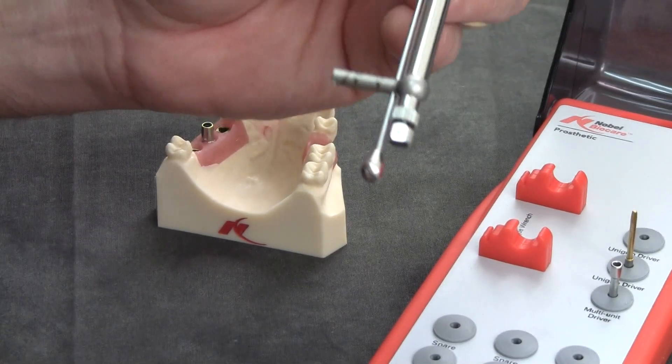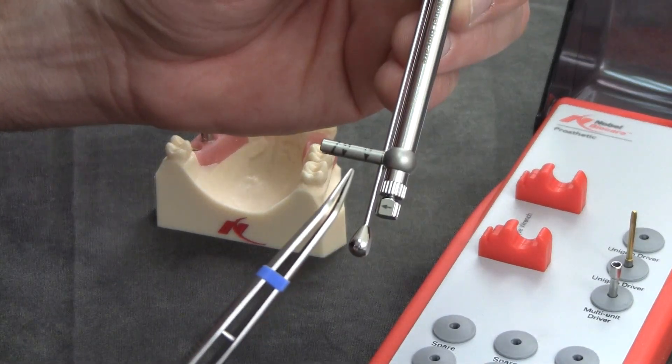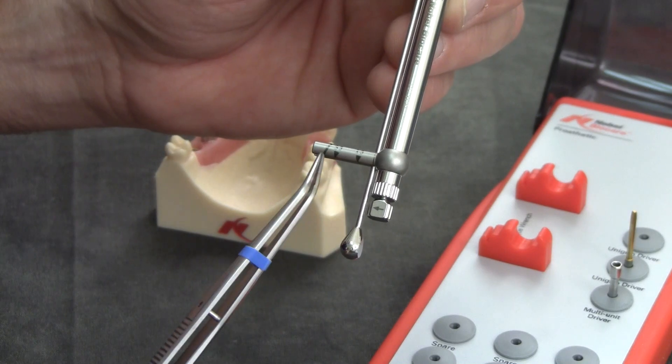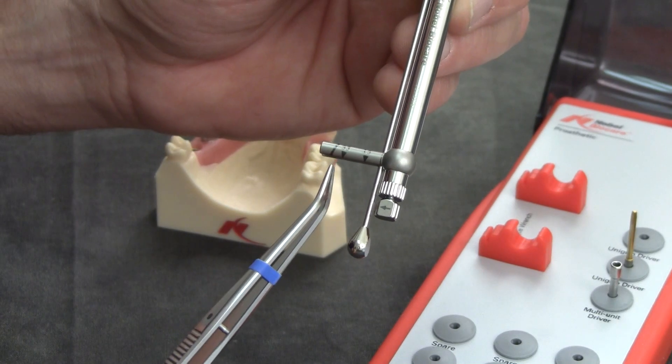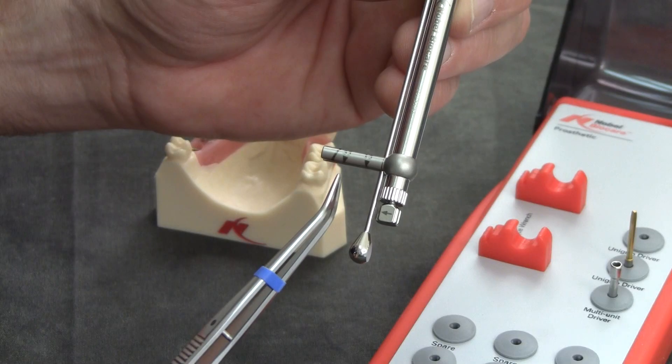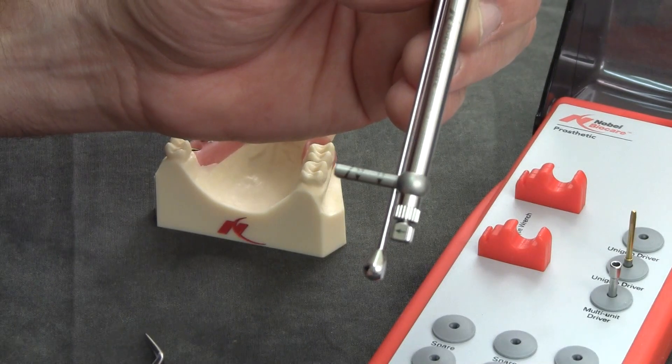Now we're ready to torque. You can also see here that it's clearly marked at 15 and 35 newton centimeters of torque. Please refer to your prosthetic manuals for the proper torque level for each screw.